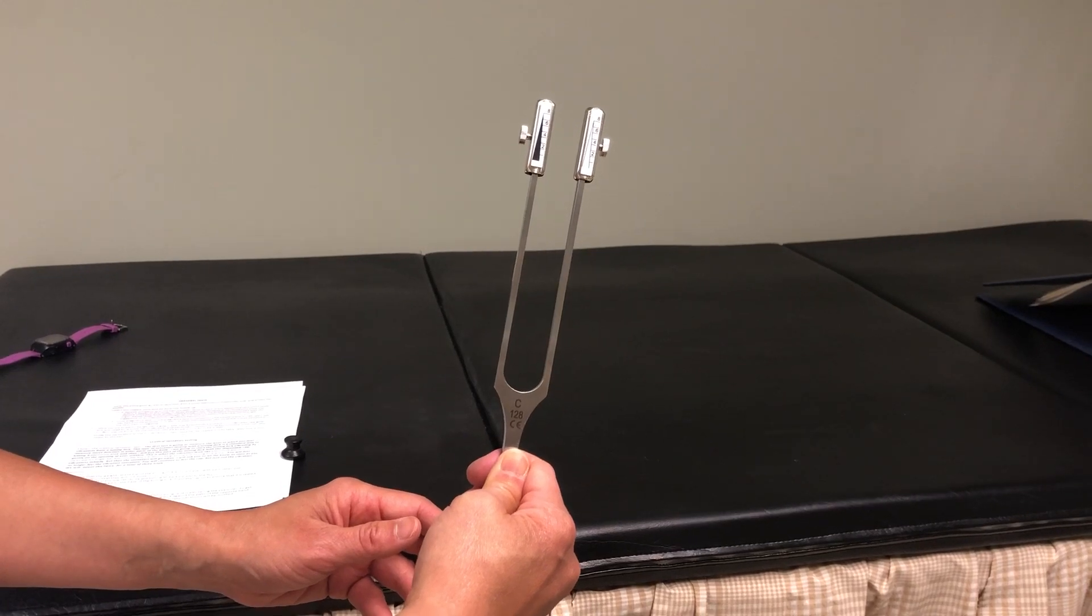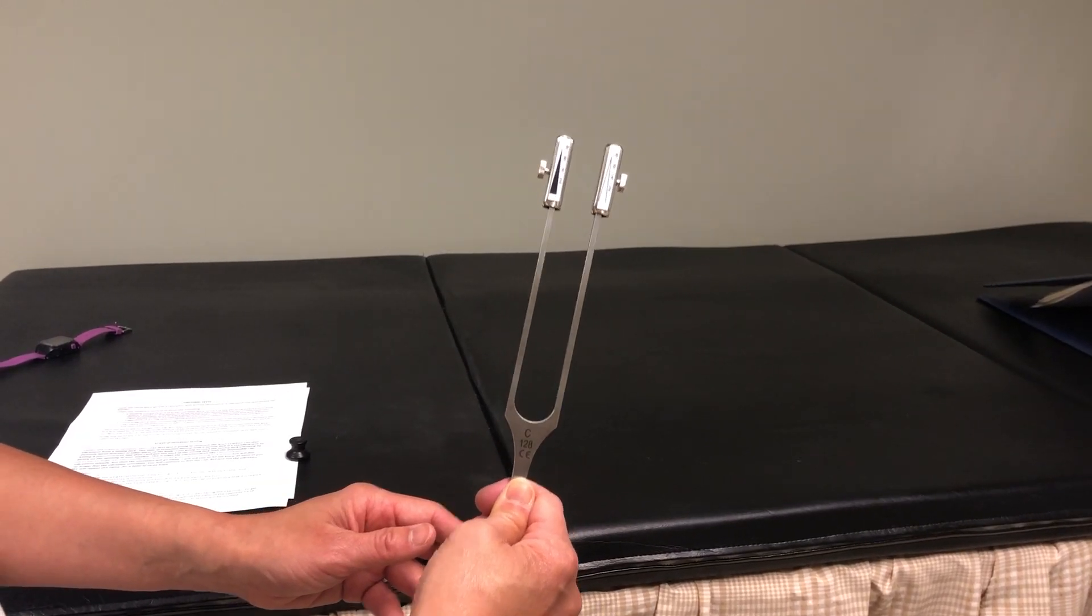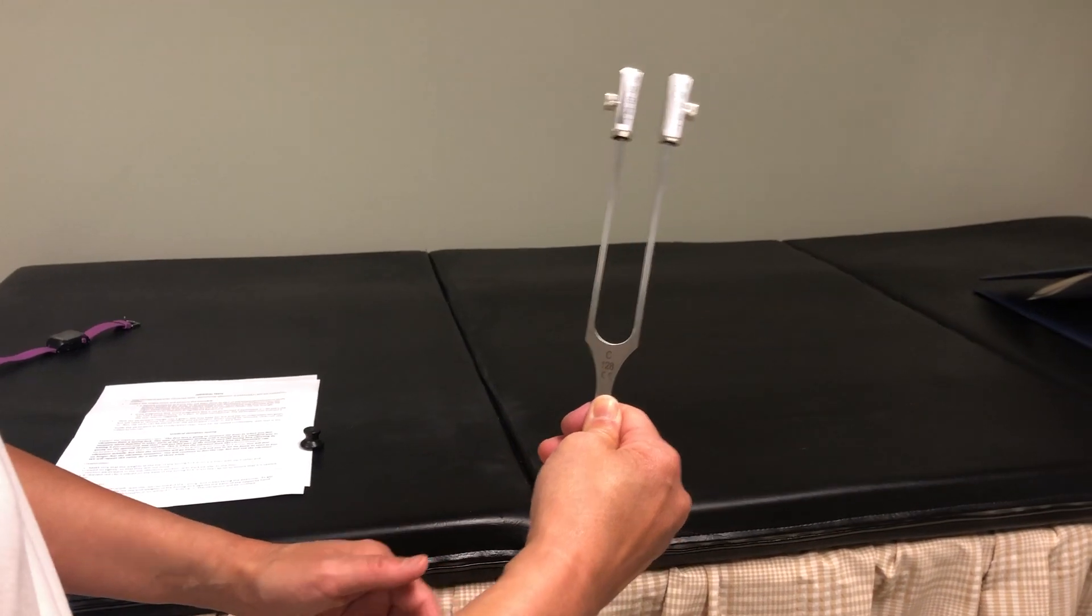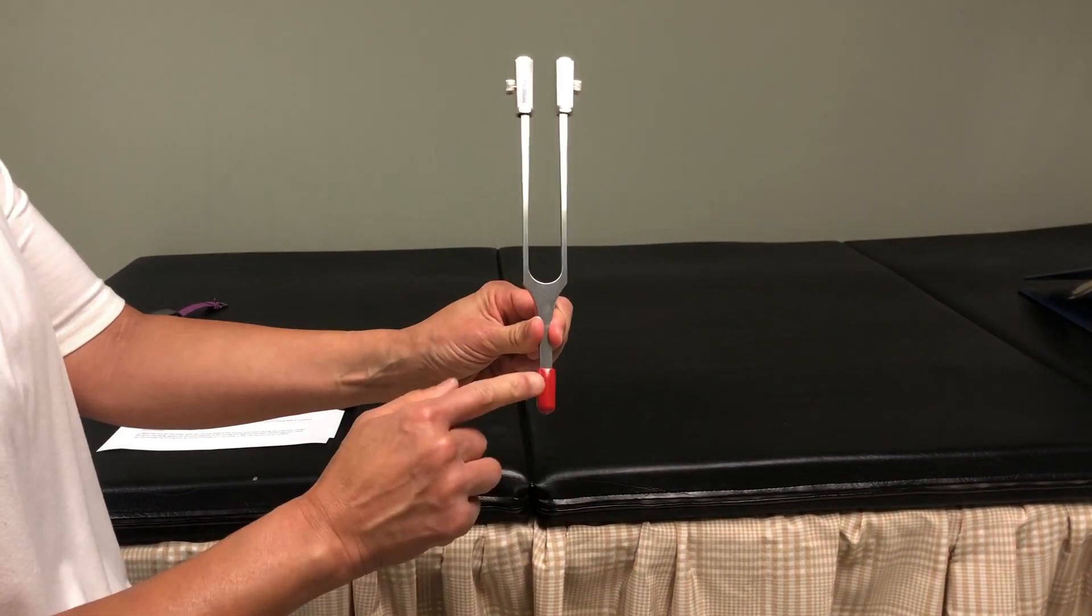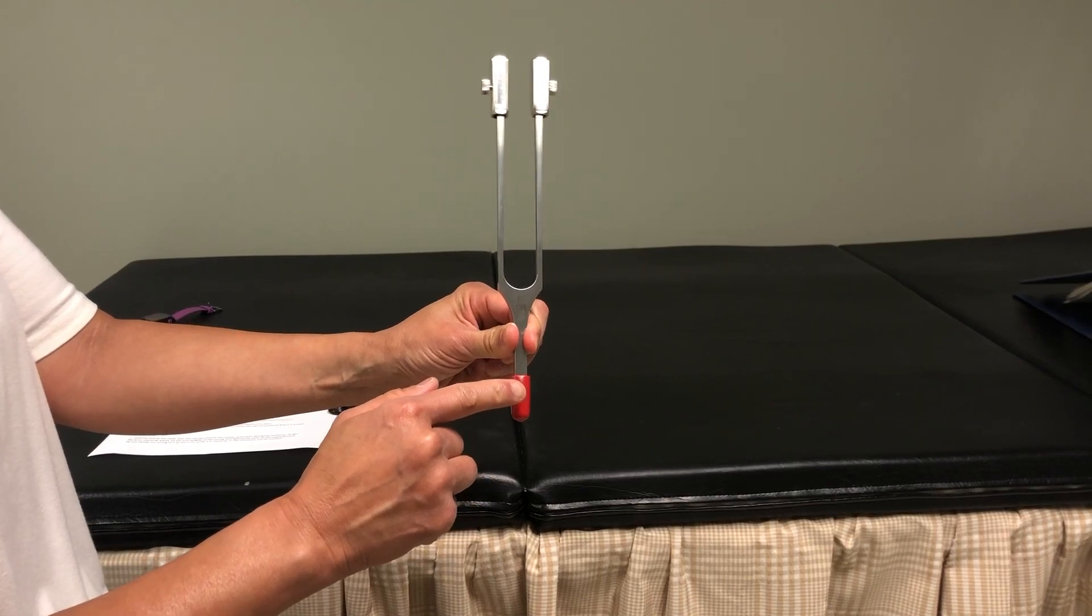I'm going to start the tuning fork vibrating by hitting it and then I will put this part of the tuning fork with the disposable cap gently on the opening of your urethra.